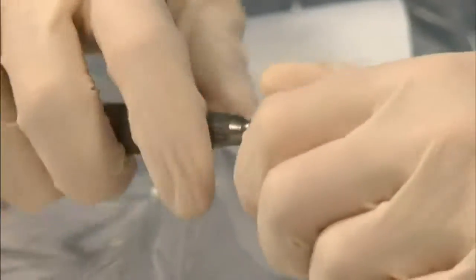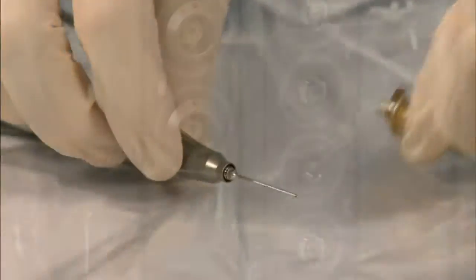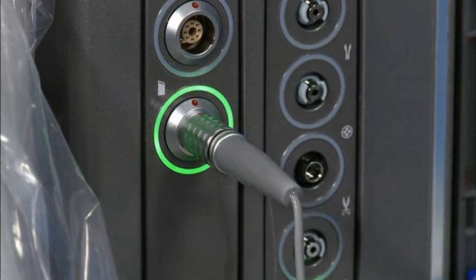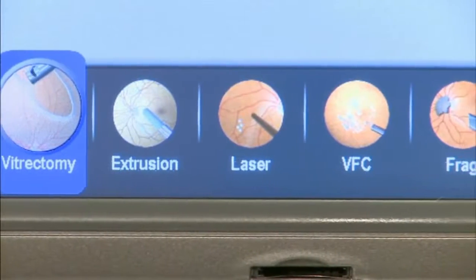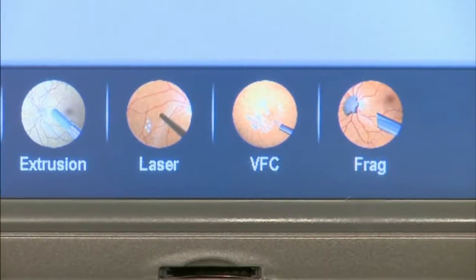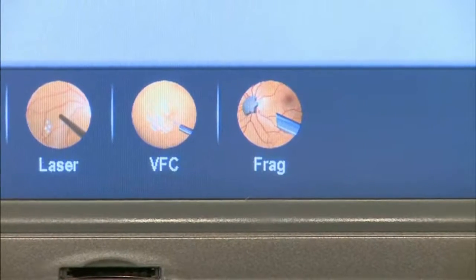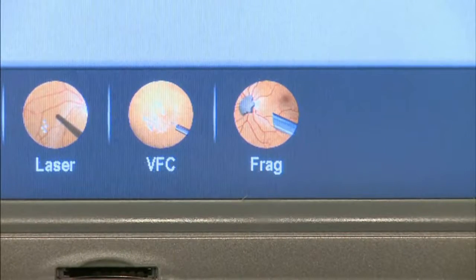Connect the fragmentation handpiece electrical connector to the ultrasound handpiece port on the console by lining up the red dots and inserting. Once the fragmentation handpiece has been connected to the console, a frag icon will appear in the Mode section of the surgery screen. When ready to use the frag, press the frag icon.